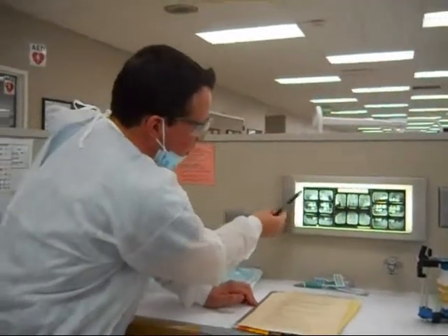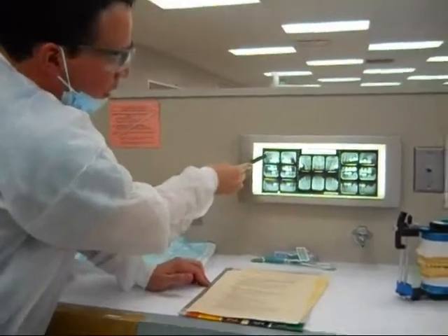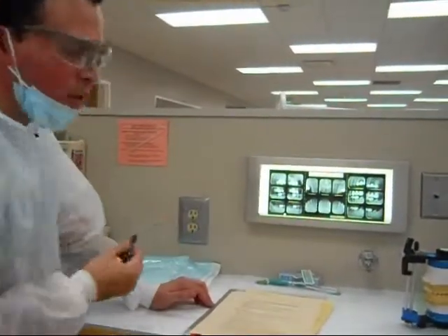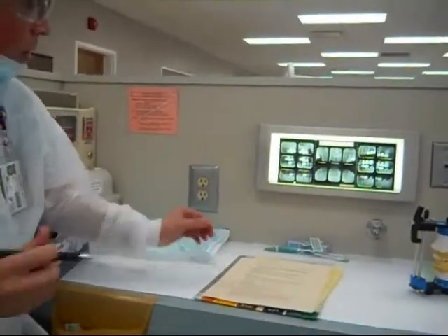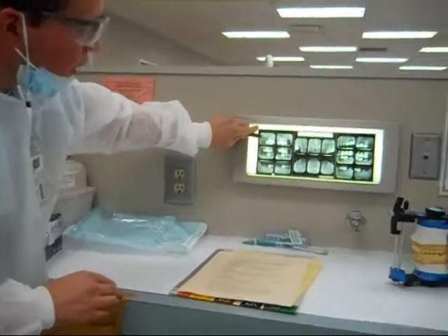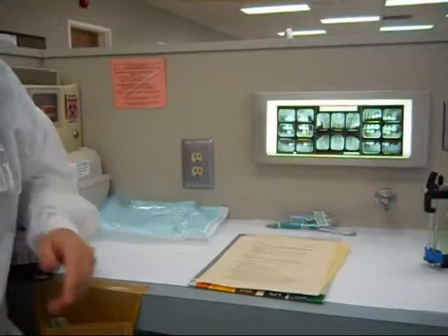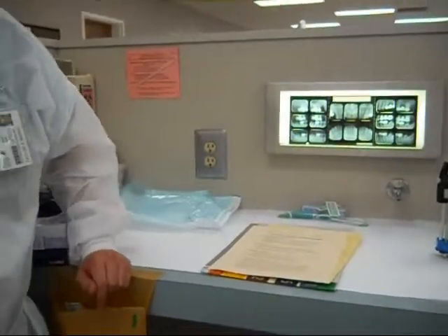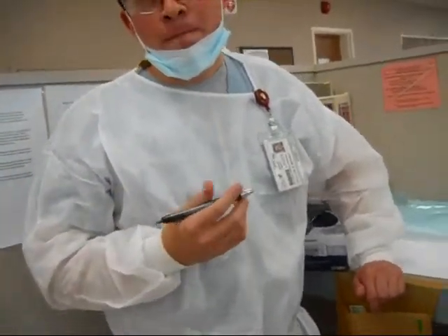You can see the root of the tooth coming up this way, and there's a little bit of this area where it's kind of darker. When it's dark like that, that usually means that the bone has started to absorb — up there at the top of the root, right in this general area. So you see this dark area along the root. It's not necessarily decay, but there's some form of inflammation that has caused that bone to start to absorb. The dark spot is where the bone isn't — it's where the bone used to be.